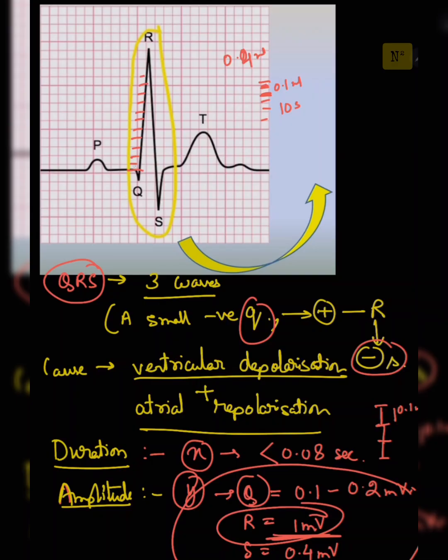Since it is not an actual depiction, you can think it is traveling at least 2 small squares more. Approximately the curve should be like this. It's not an authentic diagram, so you can judge what the wave is. My main aim in giving this picture is to explain what the millivolt is.